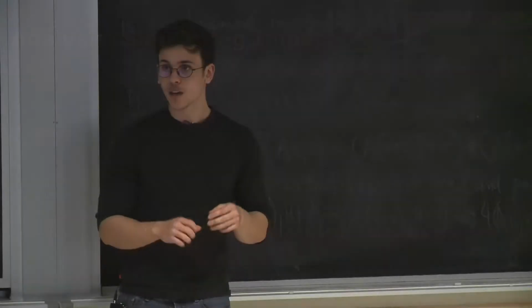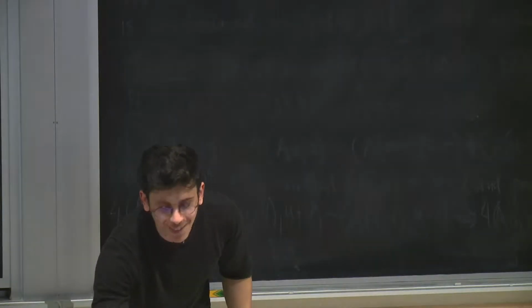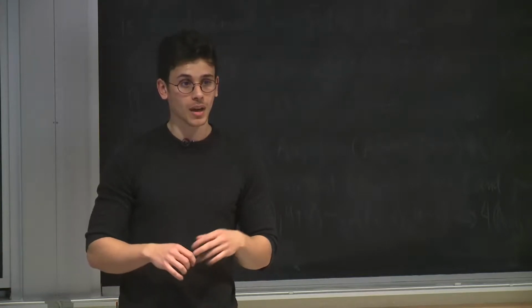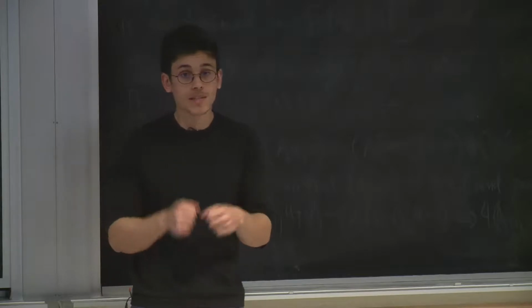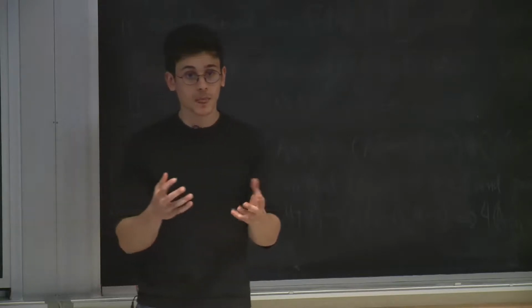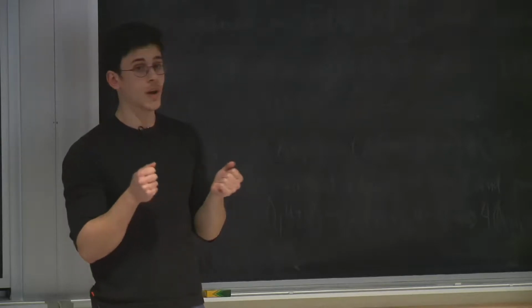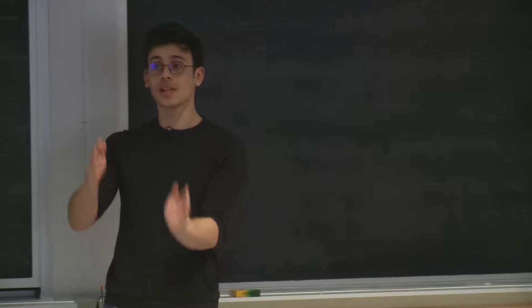So this is promising preliminary data, but to really validate this and go forward, our next step is clinical implementation, because there's a core assumption here that people read it the same way. But if you have this higher incidence, what does that mean? Can you focus more on the people that are more suspicious? And is the right way to do this just a single threshold to not read, or a double-ended one to say these are much more likely to have cancer?